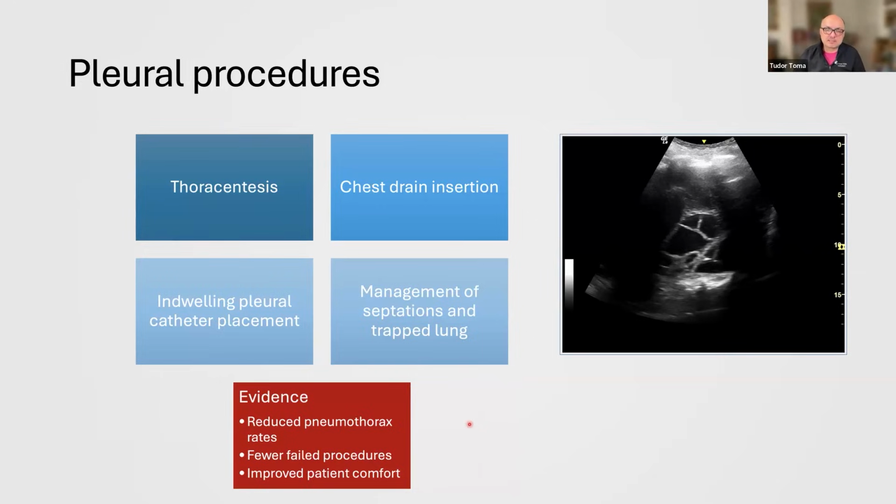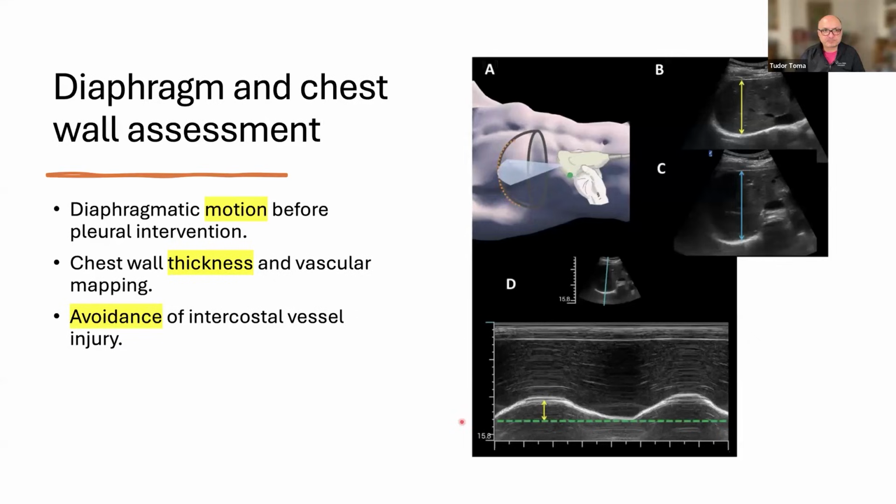We're using it, as I mentioned, extensively in our practice. We have a dedicated pleural clinic where we bring in the pleural pathology, and on a day case basis, we do the interventions. In this clinic, we have a dedicated ultrasound, and unfortunately, the pleural clinic room is not as complex as the robotic bronchoscopy room, but it's still a dedicated specific room that requires again the nurse, the program, and the whole arrangement for this intervention.